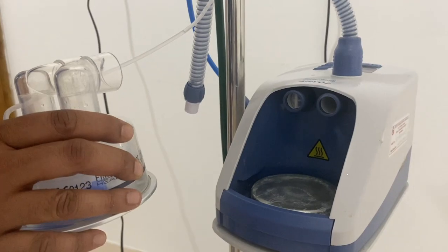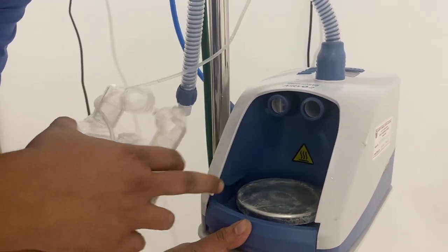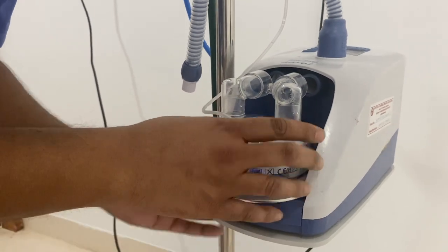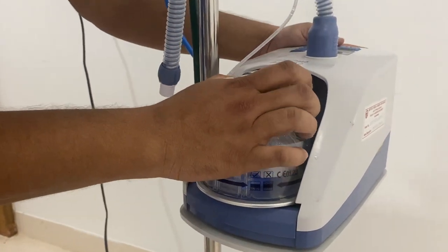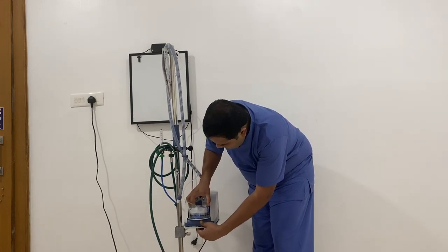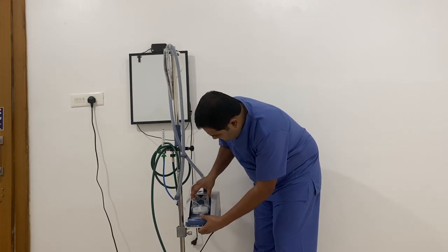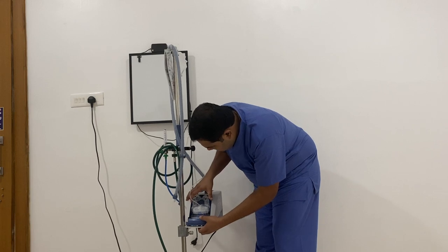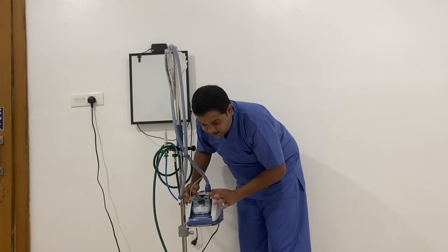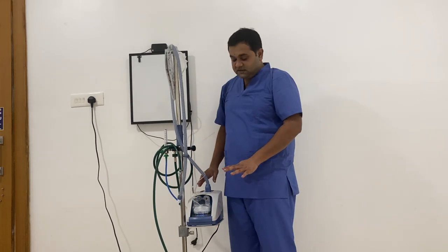This connector has to be placed down here — there is a groove to which this has to be slid. This is slid so that it fits here, and you should get a click sound. Now we know this is perfectly fitted.